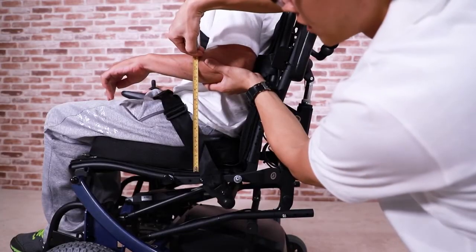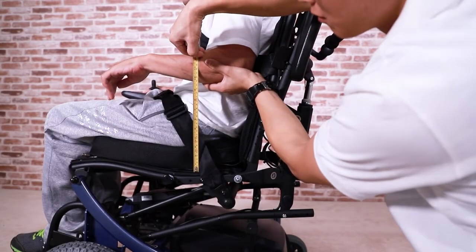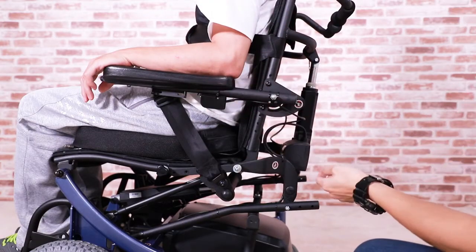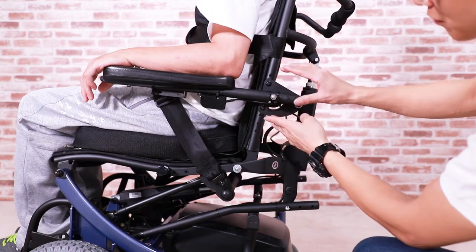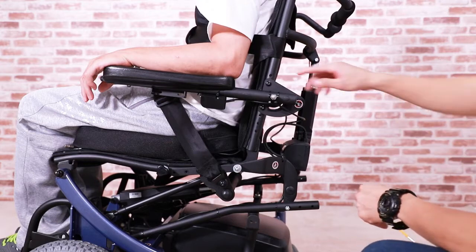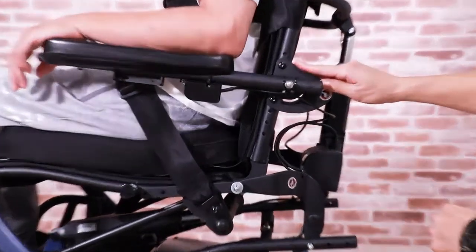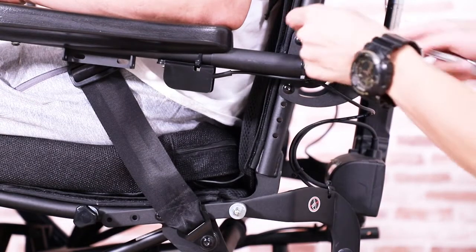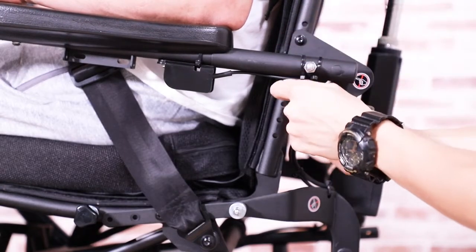After we have the armrest height, we can look at the backrest frame and find the position we want to attach the armrest. It is easy to adjust the armrest. See these 2 bolts over here? Use tools to open them.